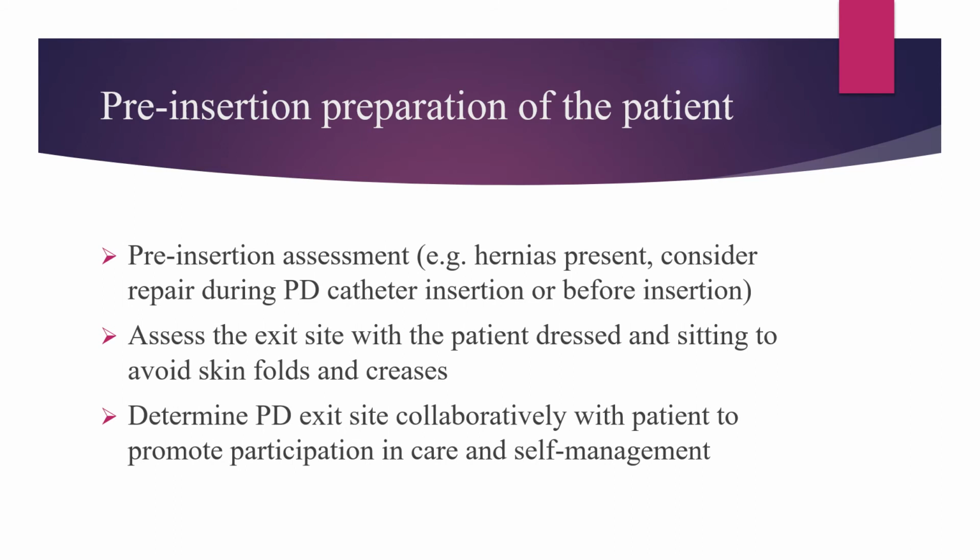Before the insertion, we need to do a pre-insertion assessment to find any problems. For example, if a hernia is present, consider repairing it during or before the insertion. Assess the exit site with the patient dressed and sitting to avoid any skin folds and creases. Determine the PD exit site together with the patient to promote participation in care and self-management.